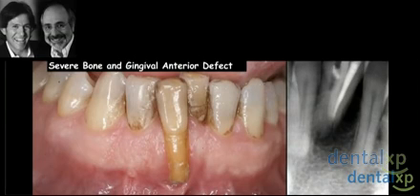If you take a look at a case such as this one, a real difficult environment, a patient that was sent to us as a consultation from an orthodontist. They'd been in Invisalign and blew an abscess around the left central incisor. The adjacent incisor was very mobile as well, and you can see it on the x-ray that we have bone on the right lateral incisor, but we've lost bone not only around this tooth, but also around the mesial aspect and facial aspect of the adjacent central incisor.